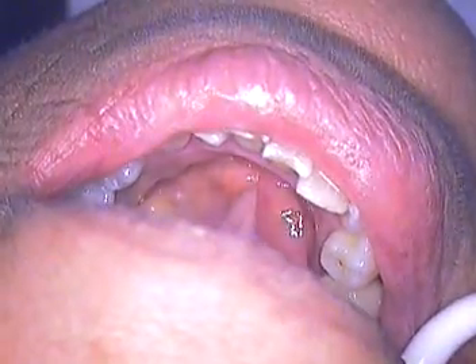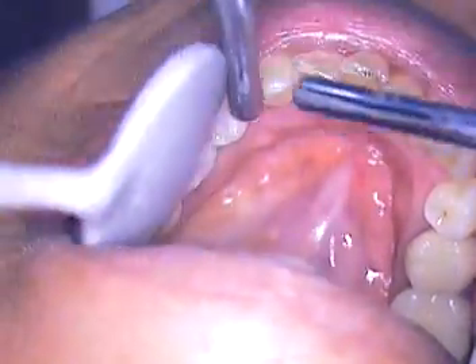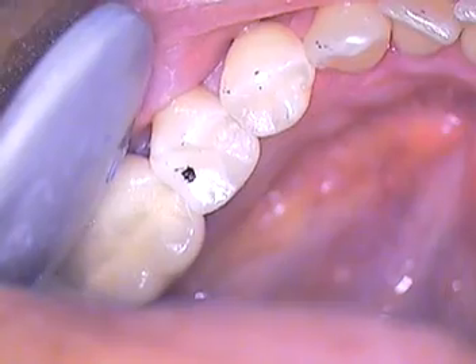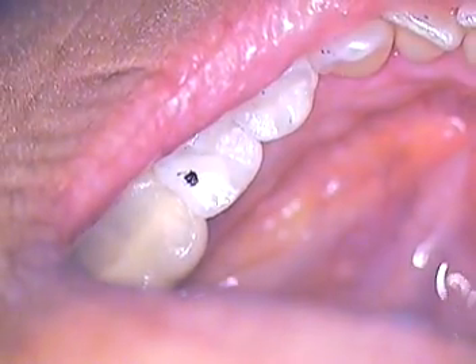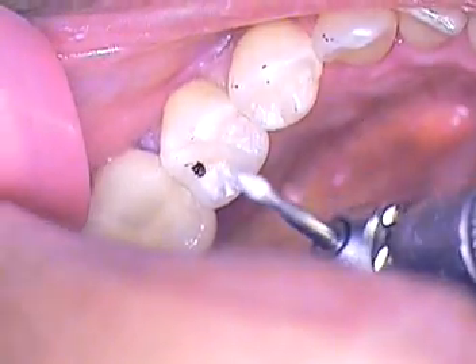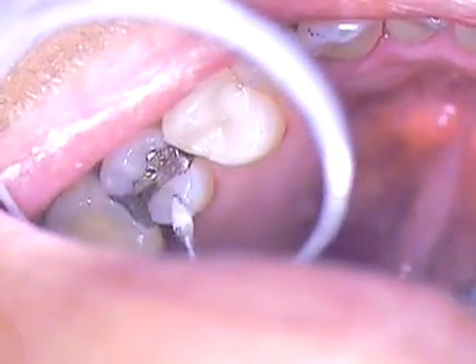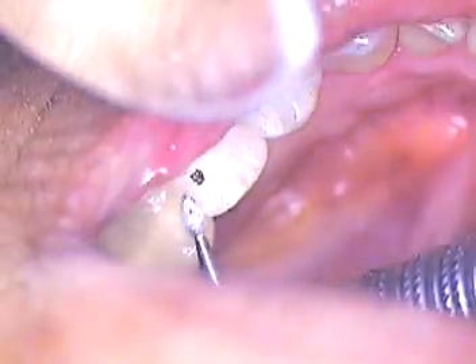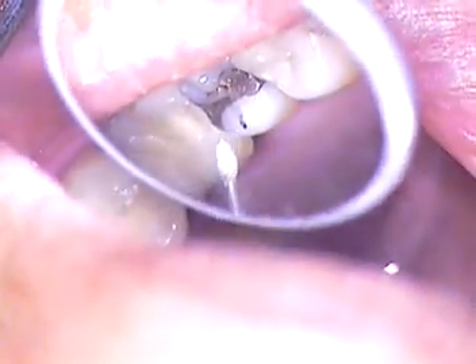We're rolling along here. First thing we'll do is just gentle tapping — we want you to tap gently three times. So there's our high spot. Notice it's not on the marginal ridge; it's actually away from that — it's in the fossa area where we want it. That's good. Now she's hitting on this cusp tip, so we may lighten this up just a hair so she doesn't get a lot of wear and tear on that area.